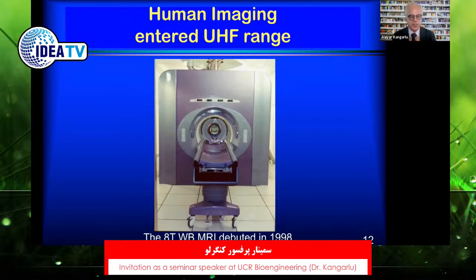This is the picture of the Ohio State 8 Tesla MRI scanner. It started on a whiteboard. We basically designed every aspect of this magnet, including the table that's sitting in front of the magnet and the gantry, in which all the electronic control of the table and patient management was incorporated. This project was truly multi-departmental.